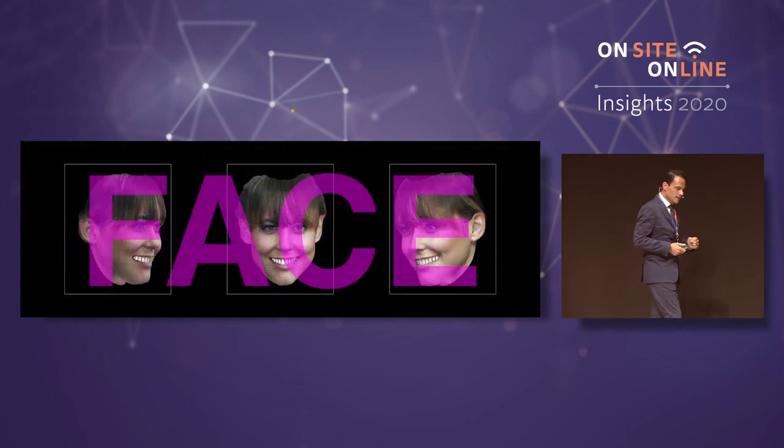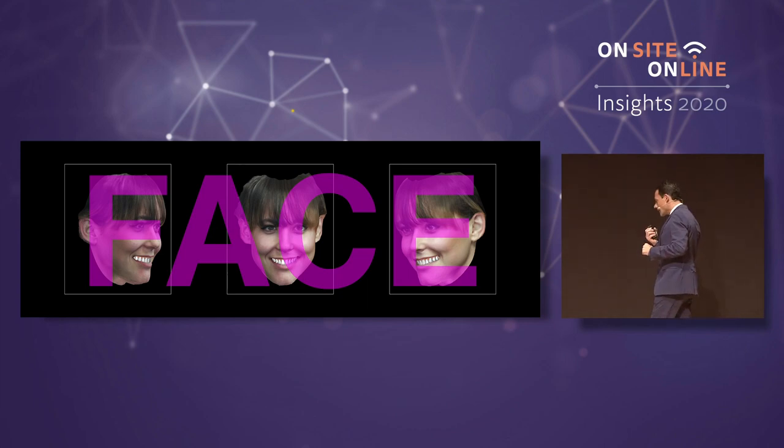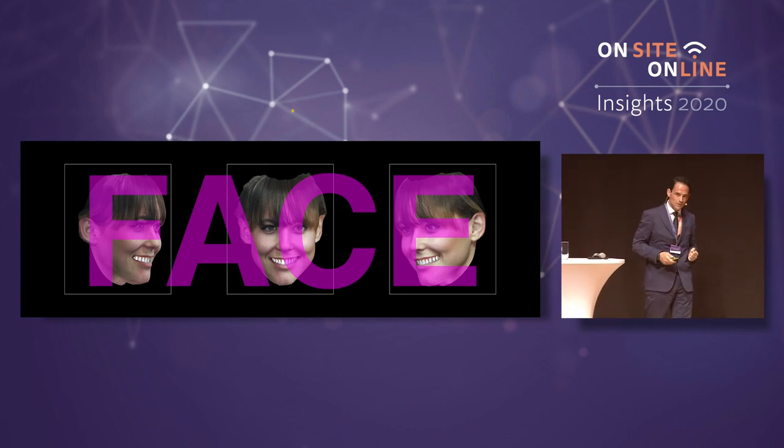Think about this. Think about the face of the patient. Imagine that it is important to have different photographies in different smile positions. I aligned it with my 3D models. Imagine that it is very important to have the face, because I can play, I can rotate, I can view, I can change the translucency of the soft tissues and see my composition in different angles.